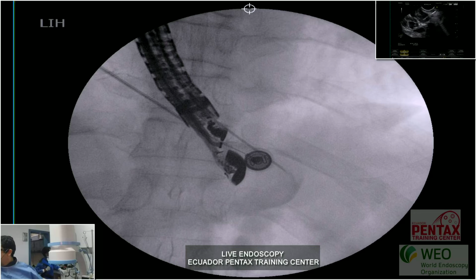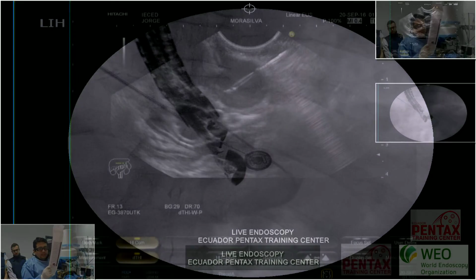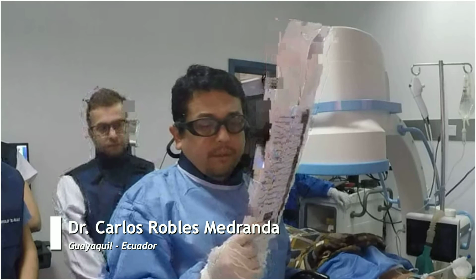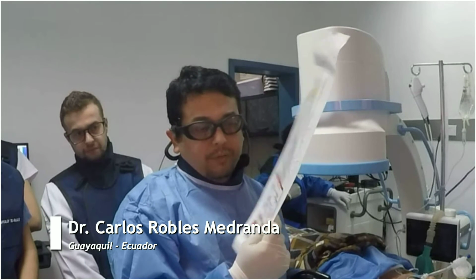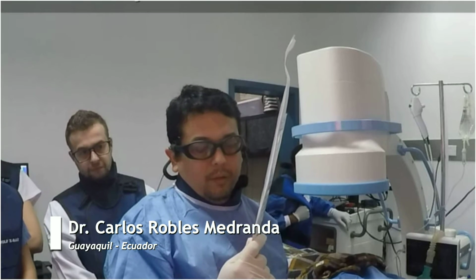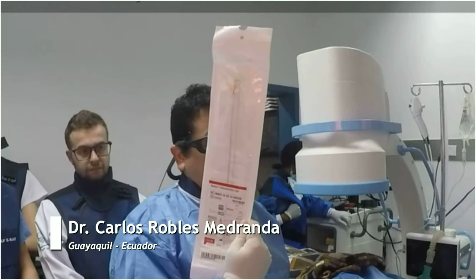Okay, so I will explain what kind of coil I will use now. We will use the Nestor embolization coil because this is a very good coil that can pass inside the 19 gauge needle. This coil has three measures. The first one is 35, which corresponds to the guide wire you need to use to push the coil. 20 millimeters is the length of the coil, and 16 millimeters corresponds to the diameter of the coil once it is deployed. I will try with this coil because this is a big varice. As you can see, we are in the feeding vessel area. Okay.